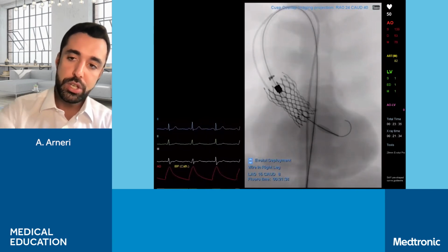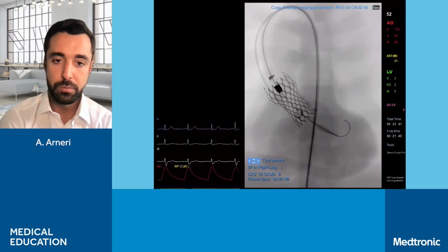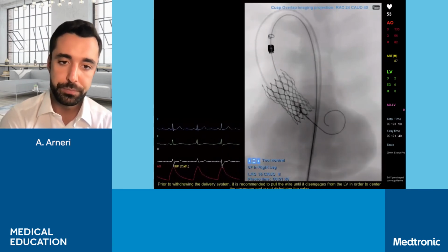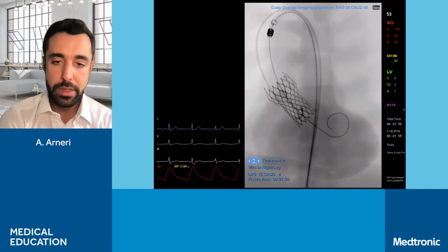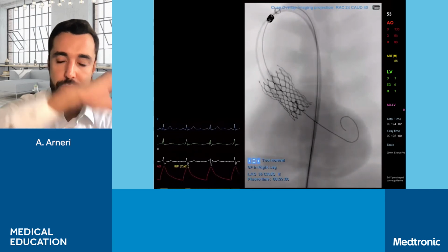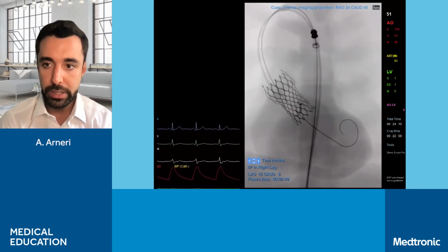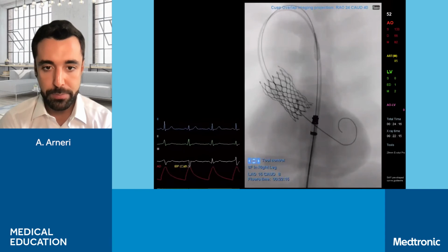Okay, in this position, we have to pull back our delivery system out from the ventricle. You see that we are not getting stuck with the struts of the valve because we are nicely centered. So here is pull back the delivery system while pushing the wire into the ventricle. And we have to place now our capsule and nose cone in the descending part of the aorta in order to recapture the nose cone over the capsule of the valve. We want to do that in a straight vessel, and the descending aorta is perfect for that.